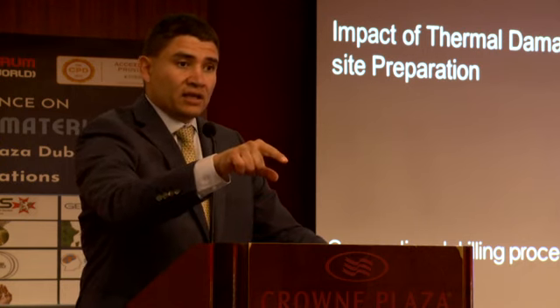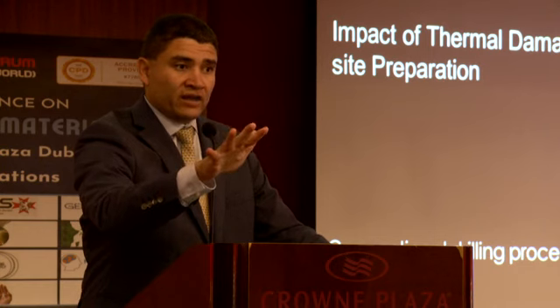Now, if I could tell you that if you were to control the heat wound or the heat shock in a wound, the curve of osseointegration is not going to be the same. And I could tell you perhaps that you can load your implants in 3 days, 4 days, 5 days, 6 days, 7 days, in a week, in 2 weeks, in 3 weeks. Would you believe me? Well, you would tell me I'm crazy, because what we have shown is a traditional curve of osseointegration with a secondary stability because of the metabolic process of bone formation. But that is because we damage the bone by heat.